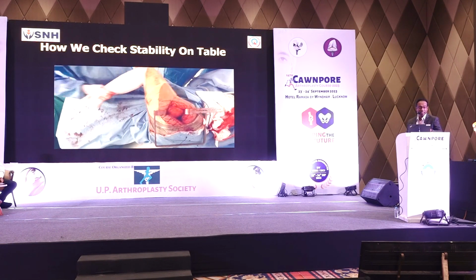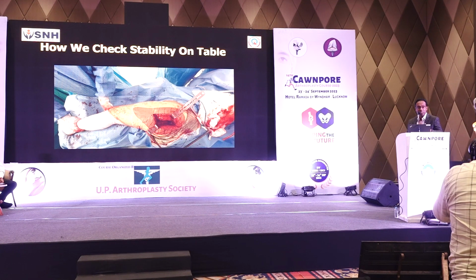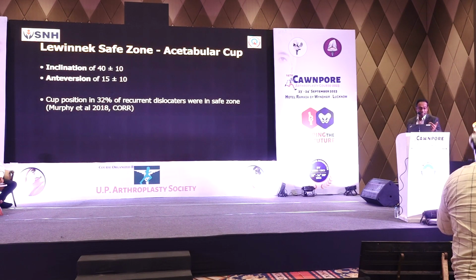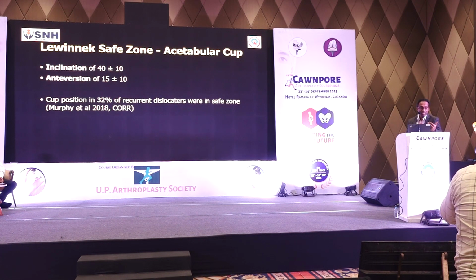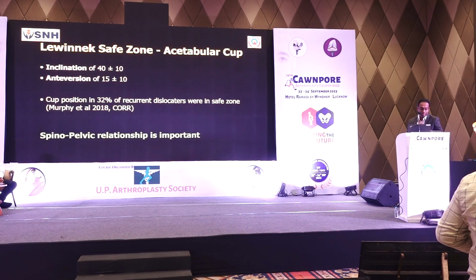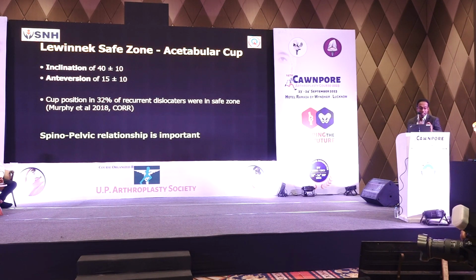We're all doing this, posterior approach, anterior approach. We keep moving the patient's hip through range of movement, and only once we're stable do we leave the table. That's what we all agree on. But in spite of that, 32% of recurrent dislocators come in a position where the cups are in good position, and still they dislocate. So the spinopelvic relationship is important and we need to take it into account.